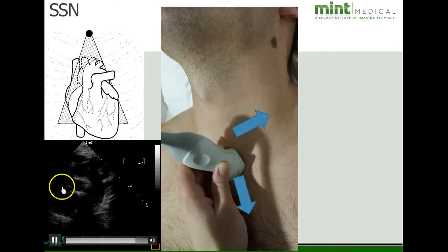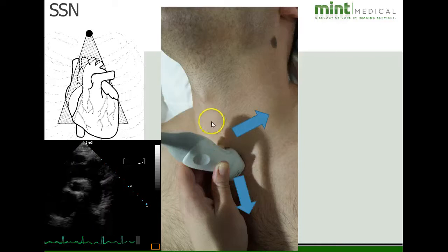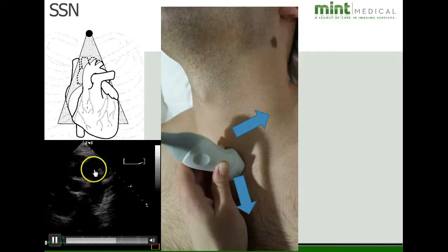This image is important to look for ascending aortic and transverse arch for aneurysms, also looking at the descending aorta for any potential coarctation of the aorta. Also, if there's any potential dissections, as an aortic dissection present in the aorta. Once again, very important angle down. Some patients have difficulty flexing their head back. You can lift the patient up and actually put a pillow behind their shoulders and have their neck flex a little bit more so you can get into that suprasternal notch window space. Obviously, some patients in the ICU and CICU have the inability to flex the head, so you try to do the best you can to get what you can for the imaging planes.